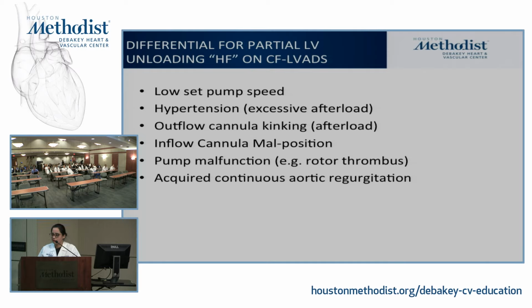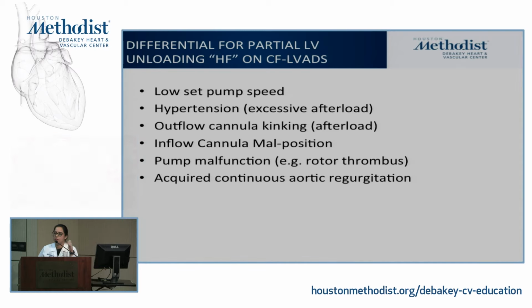What is wrong with just taking care of patients based on cath numbers? So they are in the cath lab, you go up on their speed, you see a good cardiac output, wedge less than 18, RAP less than 12, and everybody is okay. That's important, yet if I don't know how the interventricular septum is shifting or how the RV looks, let's say I went up from 8800 to 9600, and then the RV is all wide now, the interventricular septum shifts, and the free wall is more concave, that is important information to me. So that means I can't go up to that speed. So cath alone is not going to be helpful.